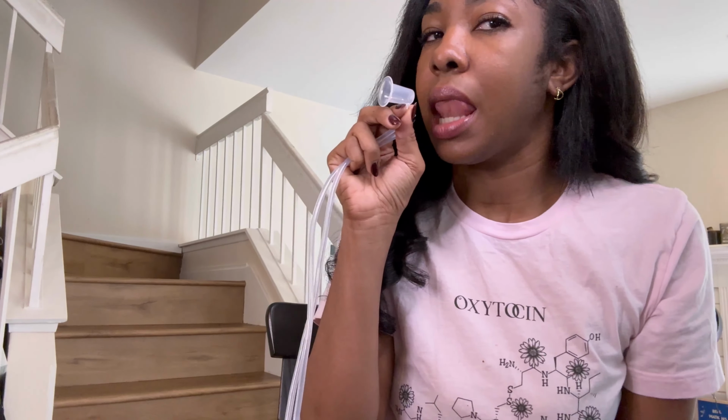After you use them, I would recommend maybe trying some coconut oil or some nipple balm on your breast or your nipples, just because there might be some level of irritation from getting used to a different sensation on your nipples, or a sensation that you've never felt before. This is the same advice that I give for people when they are using a breast pump. I like to tell them to keep their nipples protected and moisturized with a little bit of oil, just to make sure we're preventing cracks or damage to our nipples and breasts from constant stimulation.